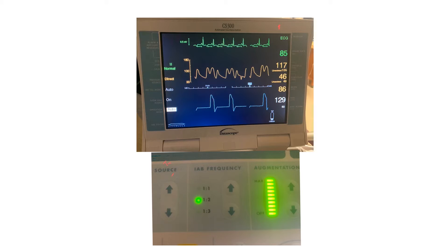The trigger source tells the machine when systole and diastole occur. The frequency is how often the balloon pump will augment — every beat (1:1), every second beat (1:2), or every third beat (1:3). The sicker the patient or the more support needed, use 1:1. As internal medicine residents, you won't be touching this — please do not — this is the cardiologist's or the cardiology team's decision.